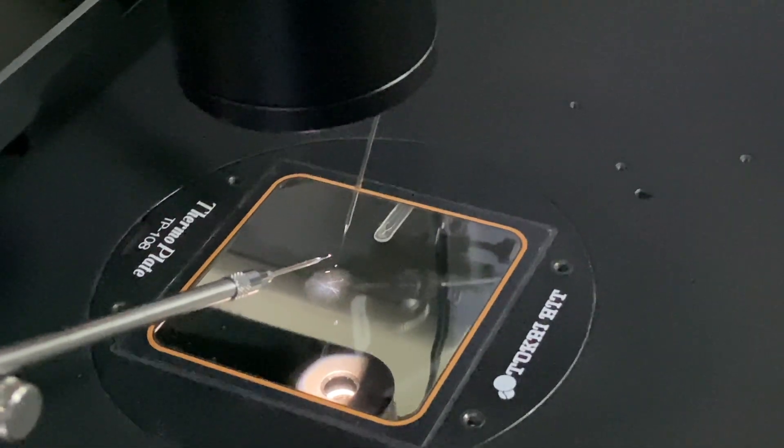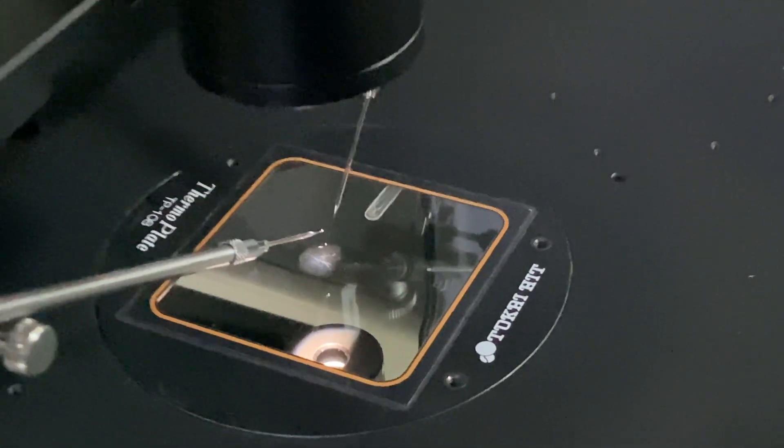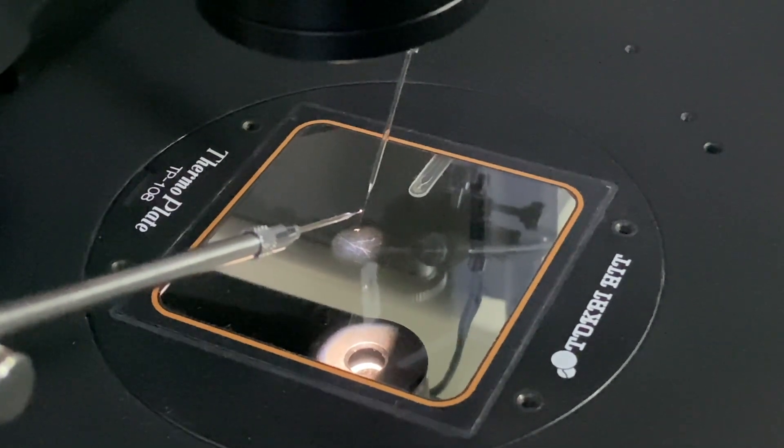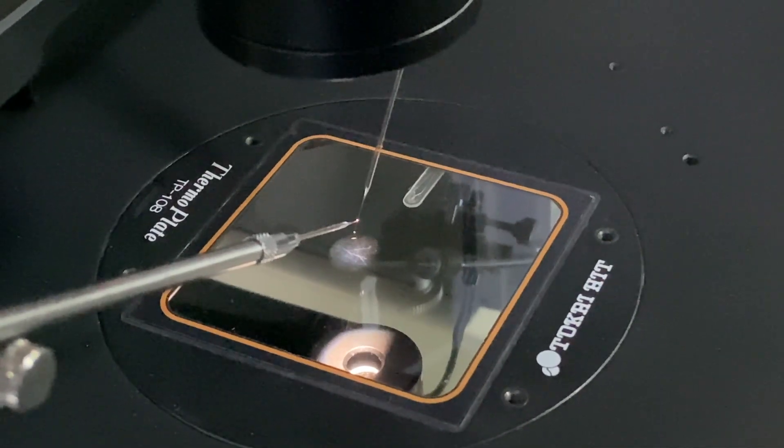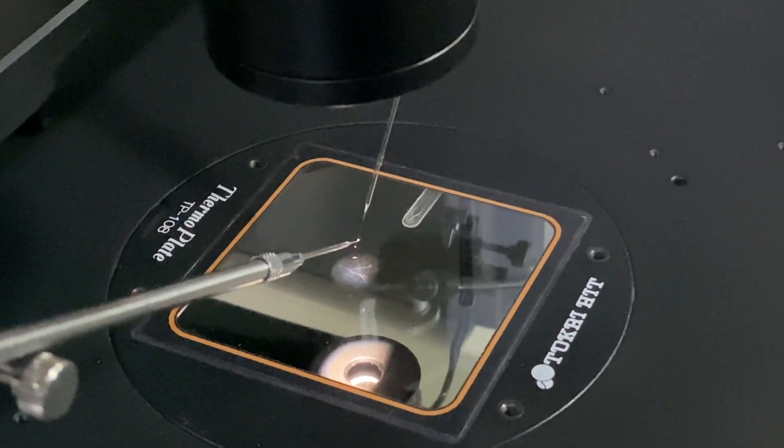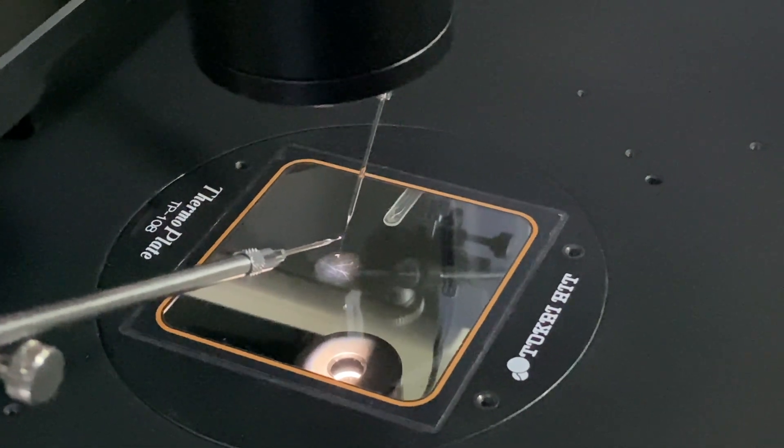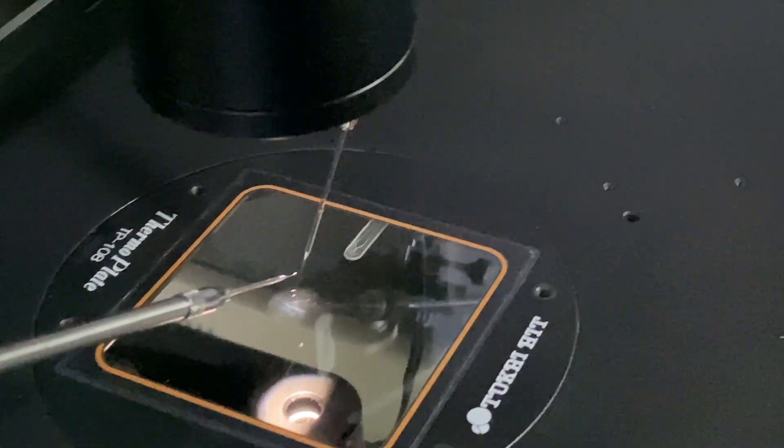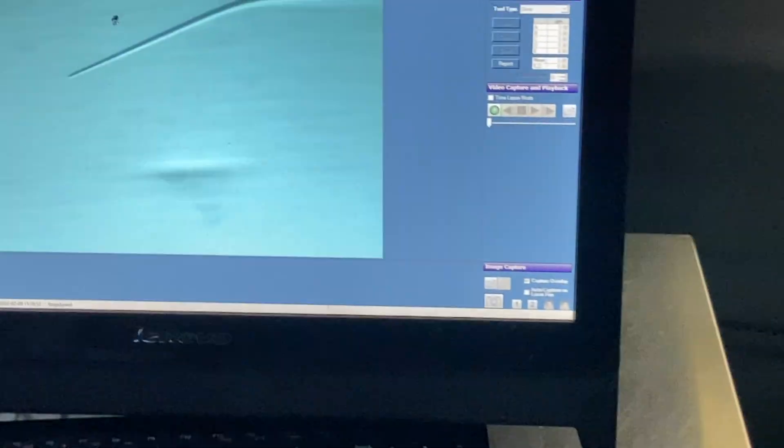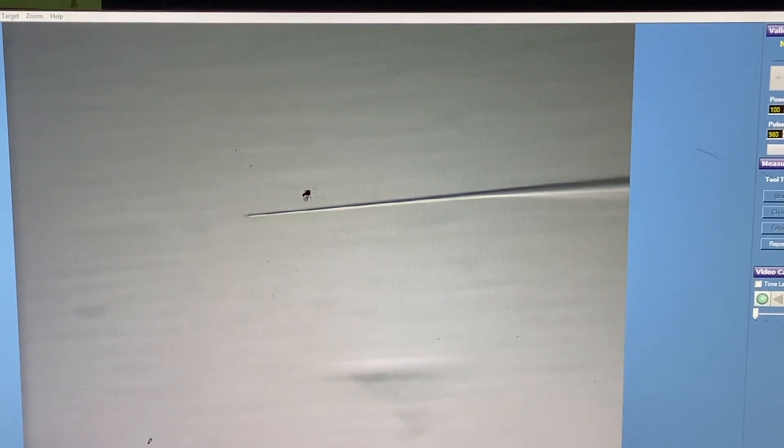So after that, what I will do is that I will bring it closer so that I can see it properly. You can see the needle. So I will just straighten it up a little bit. Now, once it is visible, that means it's focused. You can see the needle clearly there.